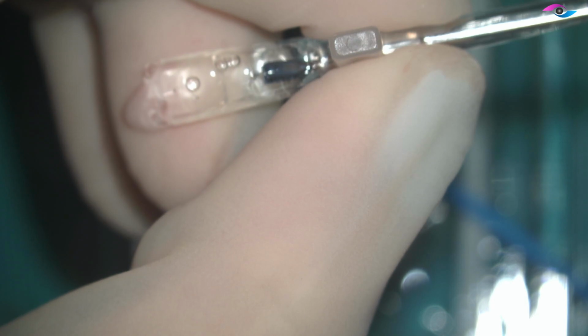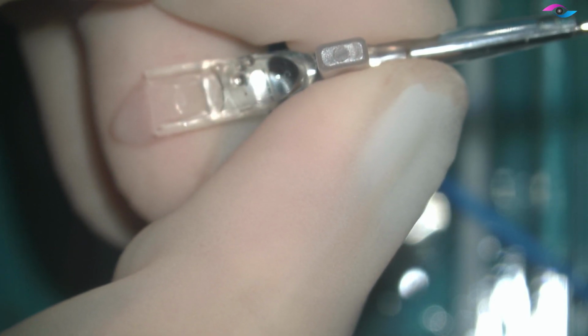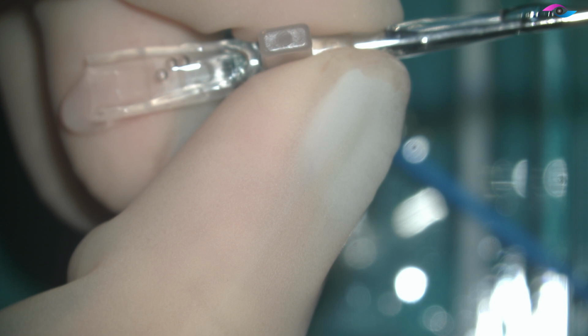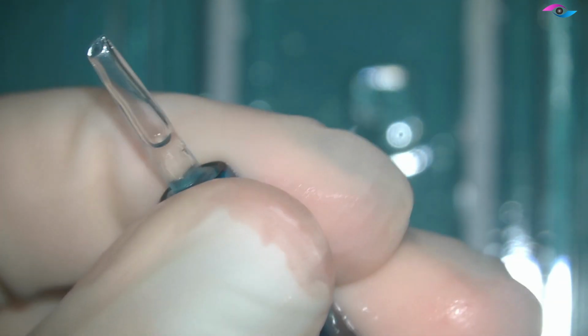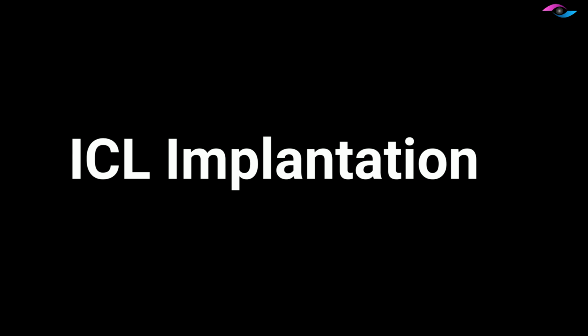Then we have the special pull through forceps to get the lens a little bit in front of the cartridge so that we can load it in the eye. The trick here is to pull this cartridge back with the other hand instead of really pulling the lens. Once this is done, we put the sponge tip applicator inside this injector and then we lock it and place the lens in place, and then we just move it forward to make sure that it's moving.